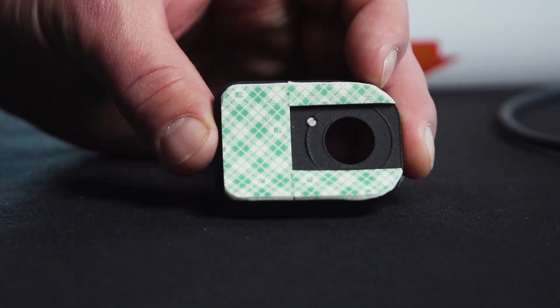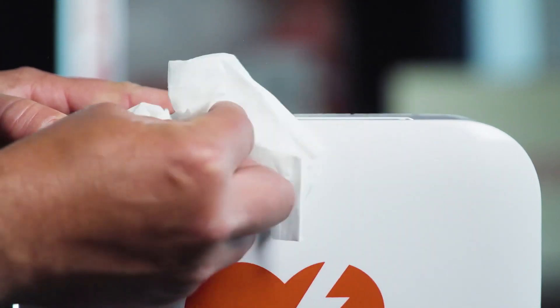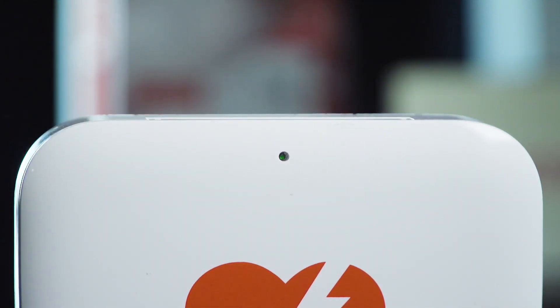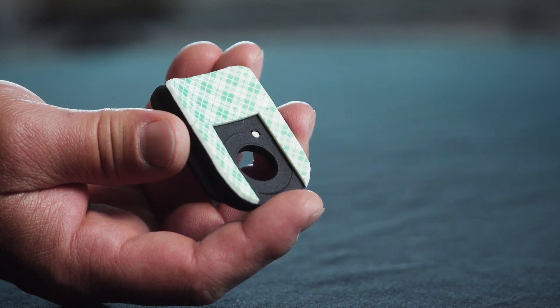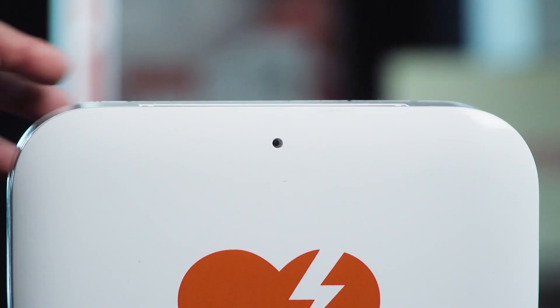The first step in the installation is to make sure that the AED's ready symbol is showing ready for rescue and that the area around the symbol is properly cleaned of any dirt or debris. Then peel away the double-sided tape and firmly place the base on the AED as shown.